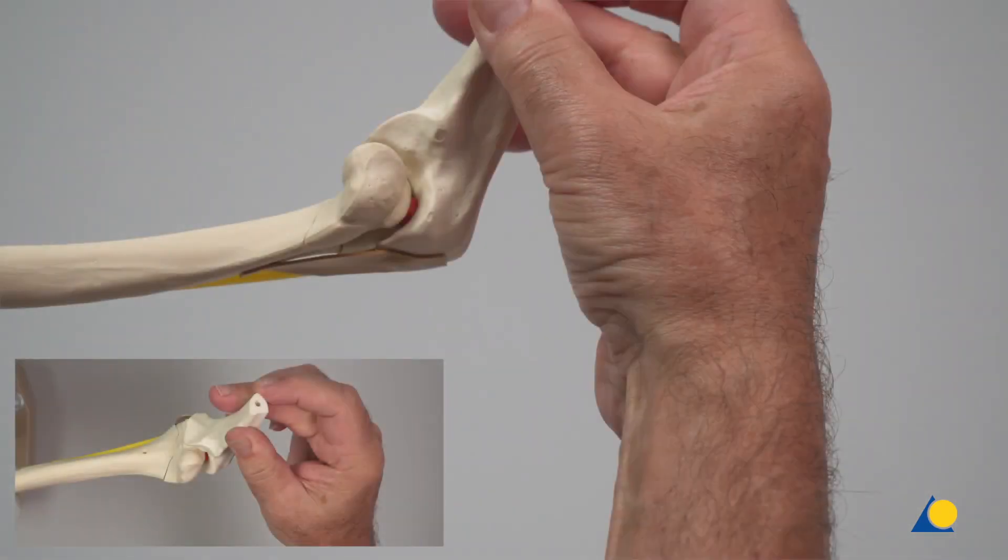In the clinical situation, the intact posterior periosteum helps in reduction and stabilization of the fracture when it is stretched while the elbow is flexed. Note that, as the periosteum is visible in this bone model, the correct reduction can easily be observed.